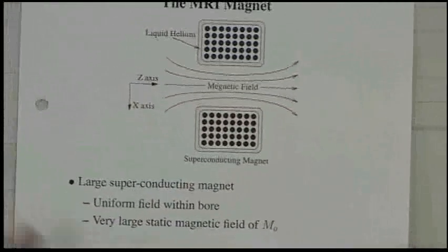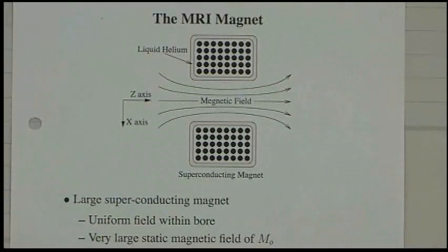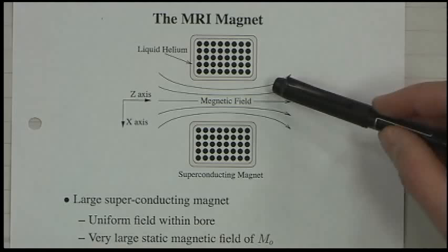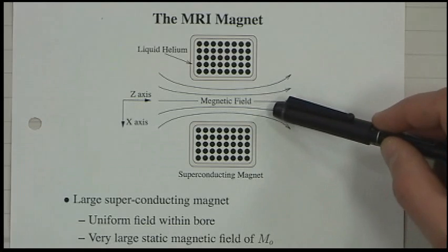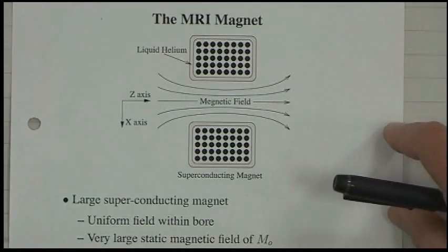Oh, also, don't walk into an MRI center with a belt buckle that's made out of ferrous material, like iron, because there's an incredibly powerful field. It'll shoot that out of there like a bullet. That's not too good. So there are safety concerns there too. Anyway, it's fascinating stuff.